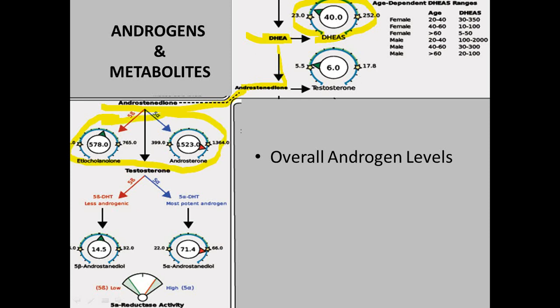And so you can see in this particular patient, one's normal, one's a little bit high. So the DHEA status looks normal to high. The testosterone, we're looking at testosterone itself, and then also these two downstream metabolites as well. For testosterone, we're predominantly looking at testosterone, and it's low normal here. So she's on the lower side of normal for this sample report.